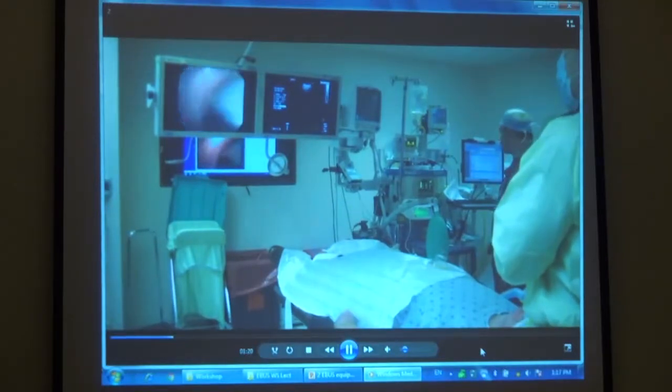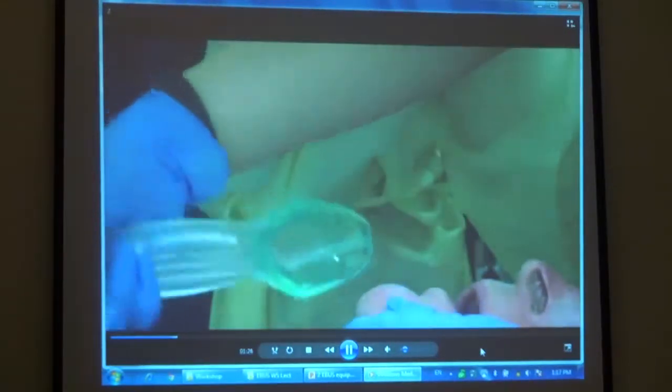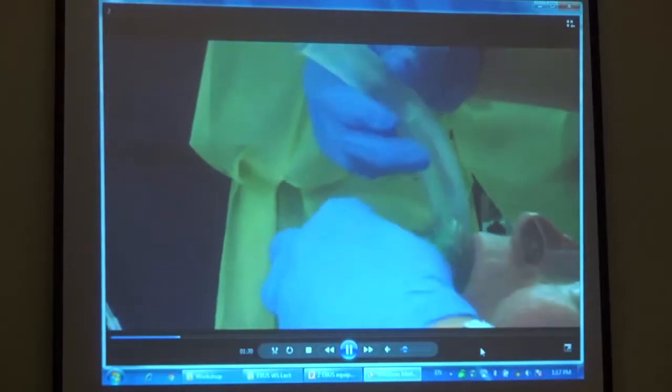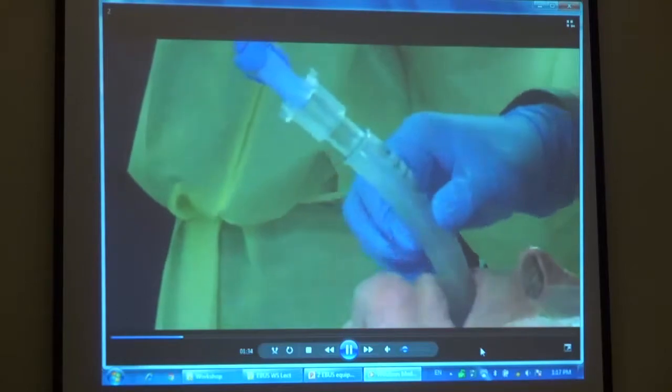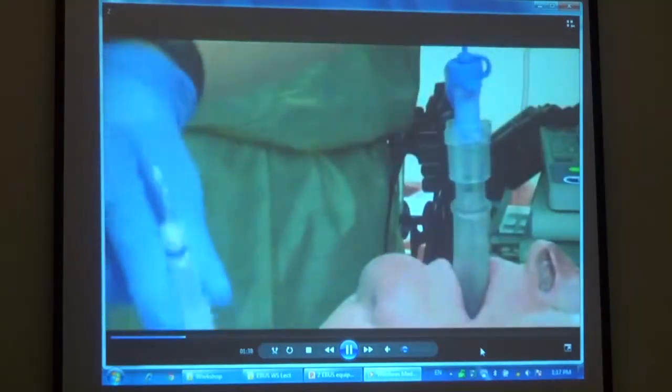Use of a laryngeal mask airway allows examination of the vocal cords and the higher paratracheal stations, which may be difficult to visualize using an endotracheal tube. However, patients at risk of aspiration, those requiring high airway pressures, and patients with a history of supraglottic tumors or neck irradiation may be better served with a standard endotracheal tube.